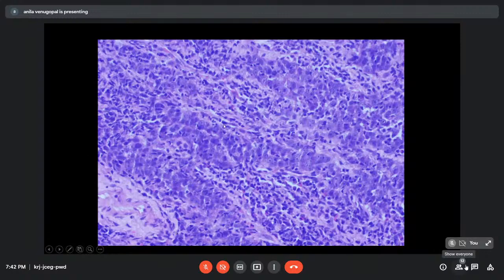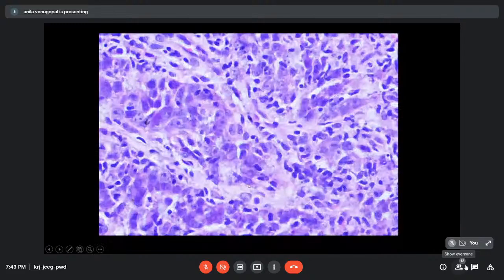This is from one of our cases of nasopharyngeal carcinoma, a nasopharyngeal biopsy, showing tumor islands which are densely infiltrated by lymphocytes. You can see that if these are broken up into small cells, sometimes it is even difficult to appreciate these large epithelial cells amidst this florid lymphocytic infiltrate. And that is actually one of the challenges in the diagnosis of nasopharyngeal carcinoma. This is a higher power view of the same, showing the characteristic morphology. In almost each and every cell, you can see prominent nucleoli.